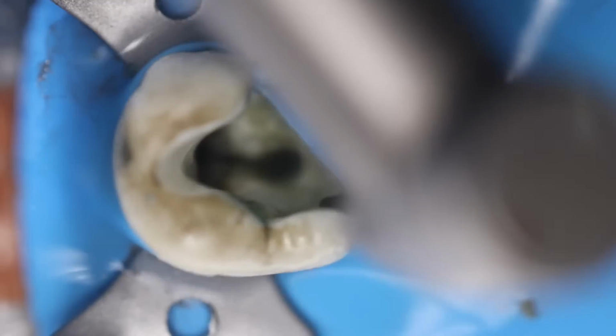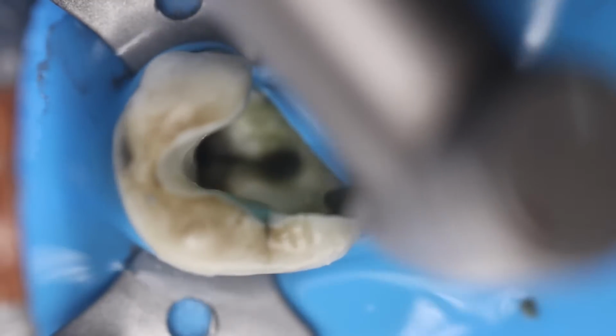I am moving it onto the pulpal floor as you can see over here, simultaneously moving it onto the wall to remove any of the weakened tooth or the carious structure. Now you can just give a slight bevel when you have attained a sound tooth structure.